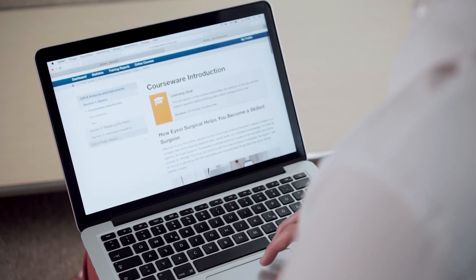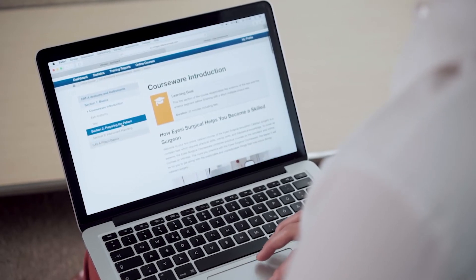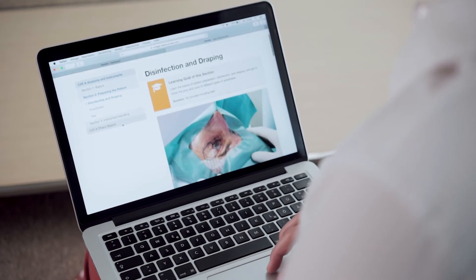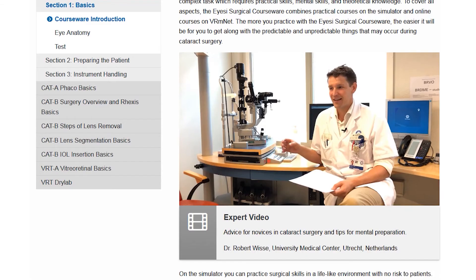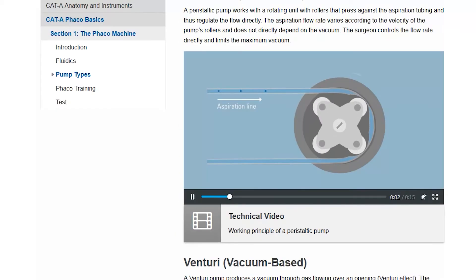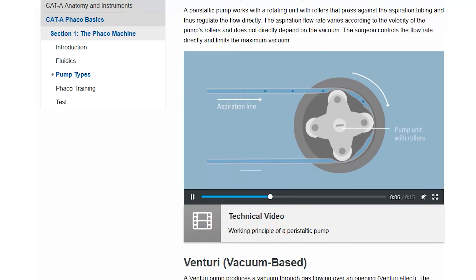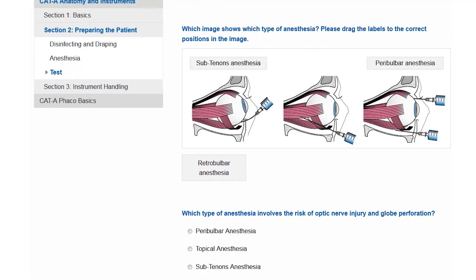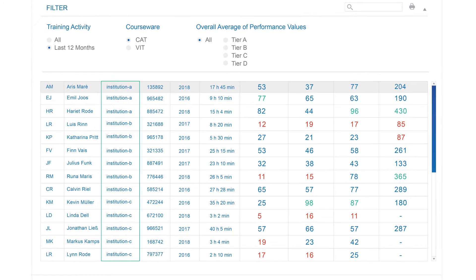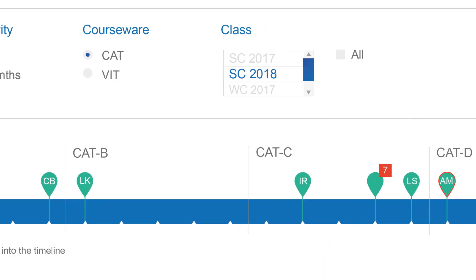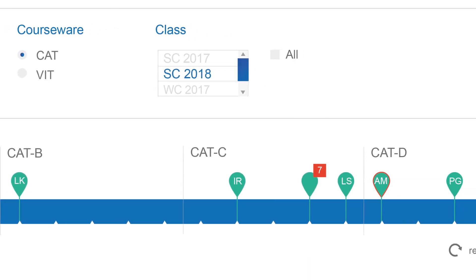Online courses extend the practical training on the simulator. Theoretical background information is enriched with videos, images, and multiple choice tests. Educators use VRM-NET to monitor their residents' training progress.